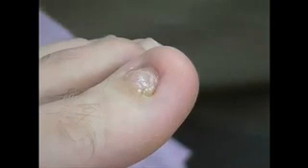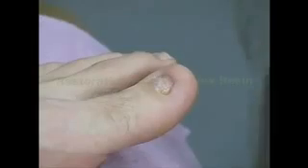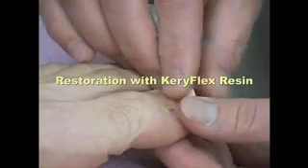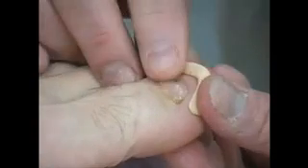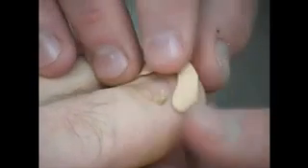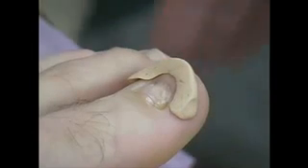This is going to take a couple of minutes to dry, and it is fairly critical when you put the solution on that you don't rush this step. Make sure you let it dry. A little long shape. I'm going to try to adhere it here. I use magnifying glasses with a light. It really helps. It magnifies the toe. It helps with the contouring. I think it gives a little better appearance too. So we've got our little silicone platform, and I'm going to try to build out to it.